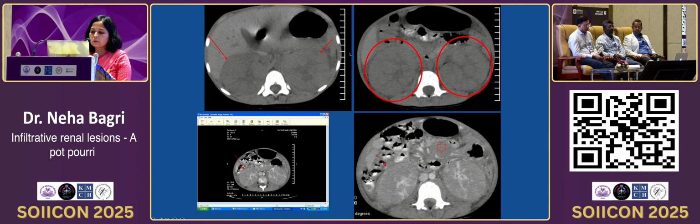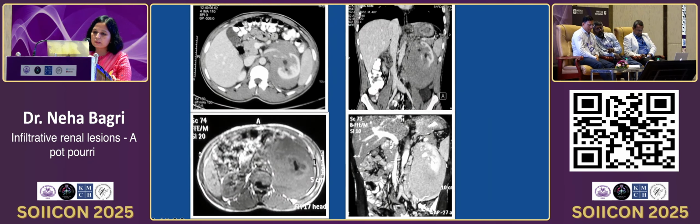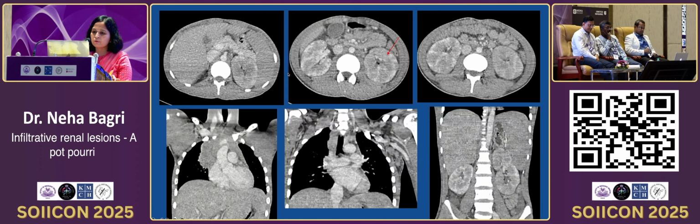So this is renal lymphoma. So you can see both kidneys enlarged in presence of lymph nodes. So another case, perinephric soft tissue secondarily infiltrating the left kidney along with presence of nodal mass. So this is another form of presentation of renal lymphoma. So this is how you should describe the mediolateral extent of the mass very clearly for the surgeon and associated lymph nodes. Another thing over here, the perinephric soft tissue, the predominant presentation with secondary infiltration of the kidney. This is one presentation of lymphoma.